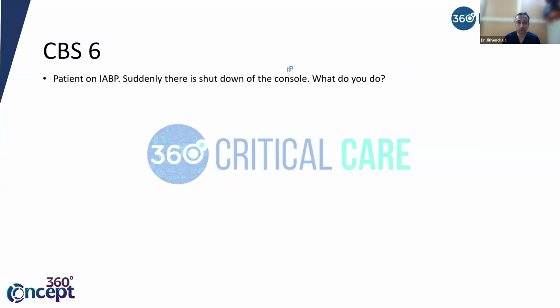What do you do with the machine was the question. Increase vasopressor. So that's what you'll maintain. I mean, medically, whatever is possible, you'll be doing. Change the machine. Yes. So that will all take some time. In the meanwhile, what you're supposed to do is you will manually inflate and deflate the balloon. How do I do it?